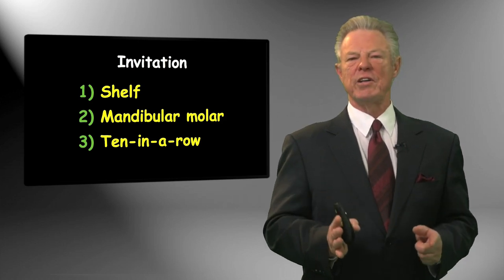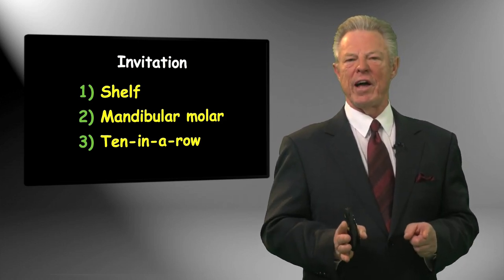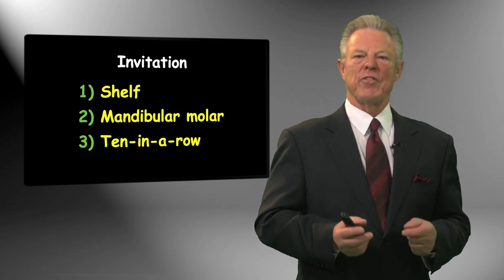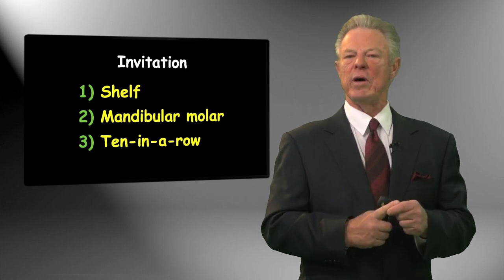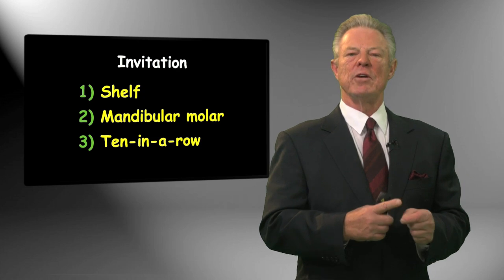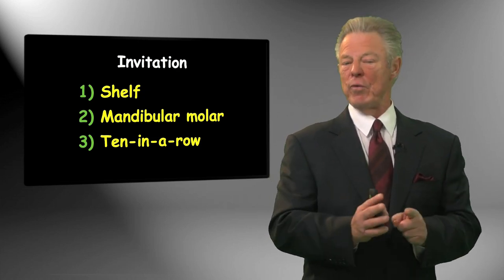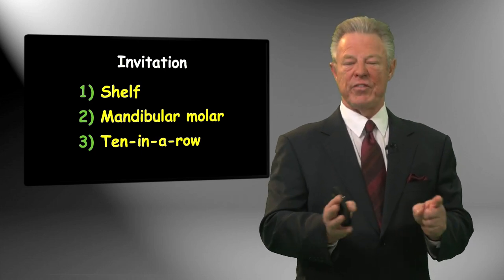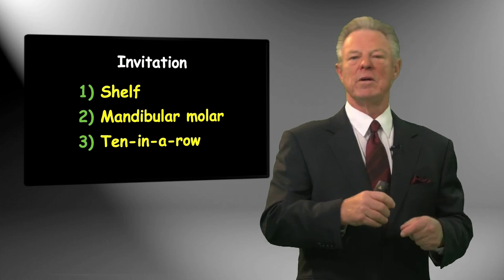I mean, I can talk to you till the cows come home, and you can read articles and listen to the science, but it doesn't mean a darn thing if it doesn't work in our hands, does it? So what I would suggest to you is document this. Start with patient number 1 on Monday or whatever day you choose, a month from now, and treat 10 patients in a row using new rotary instruments of whatever is your preferred instrument system, whether it's hybrid or a singular system. And then just write down your experiences, what worked, what didn't work.